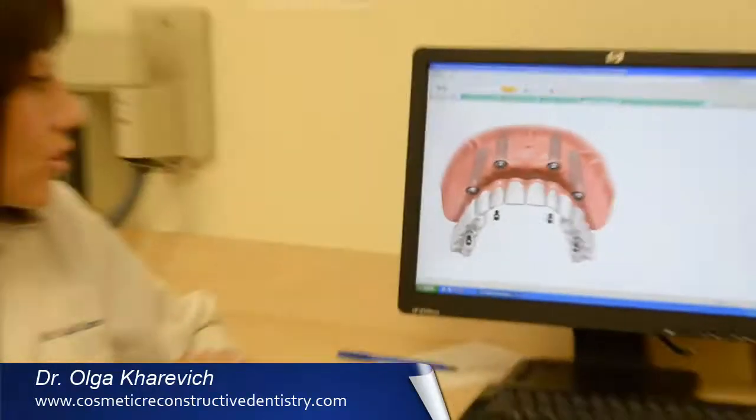I wanted to emphasize that this is still a temporary prosthesis. We usually recommend in 5 to 6 months to change this prosthesis into the final. The final prosthesis can have either a metal substructure with plastic teeth, or a metal substructure with porcelain, or a zirconia substructure with porcelain. Of course, porcelain teeth look nicer and more natural. But again, this is a question every patient decides for himself, because the difference in price is quite obvious. Usually it takes about 2 to 3 months to produce the final prosthesis. So in about 8 months you will have a beautiful, absolutely gorgeous, natural smile.